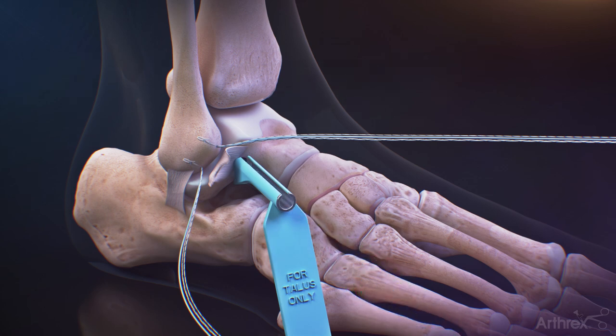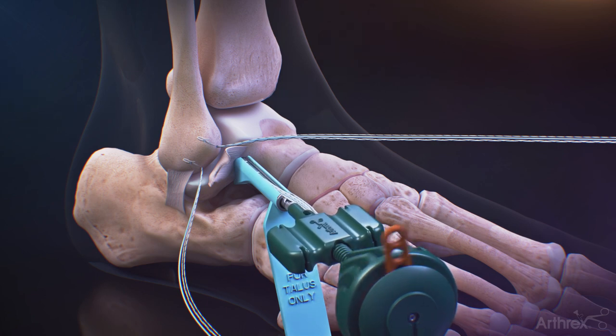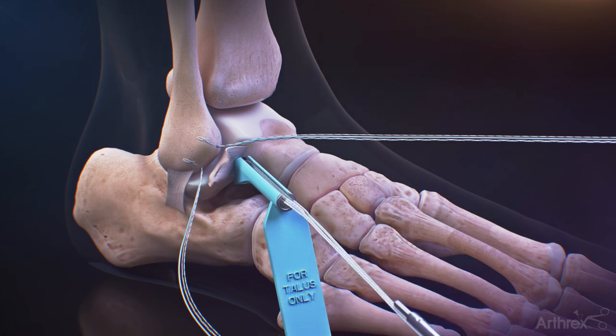Leaving the guide in place, insert the 4.75 mm swivelock into the talus. Remove the inserter and the guide.